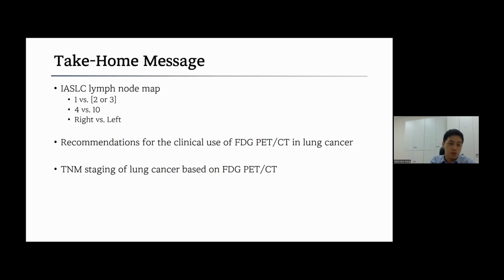I hope new tracers such as FAP can somewhat differentiate between these kinds of false positives, but I think finally it cannot differentiate between lung tuberculosis and lung cancer.